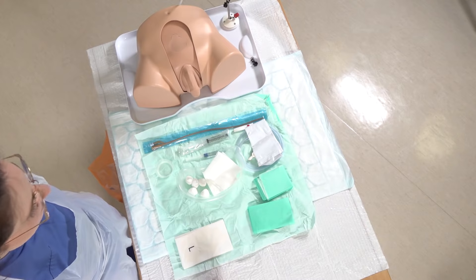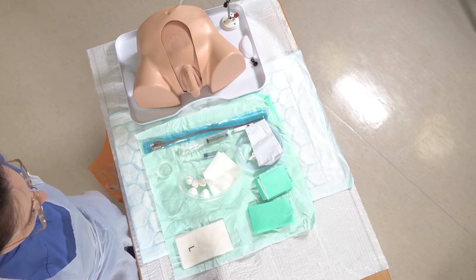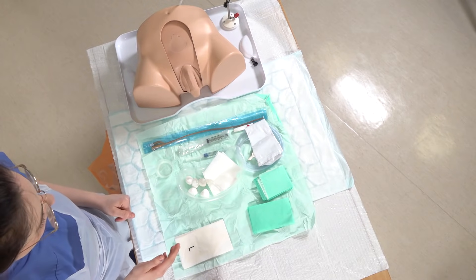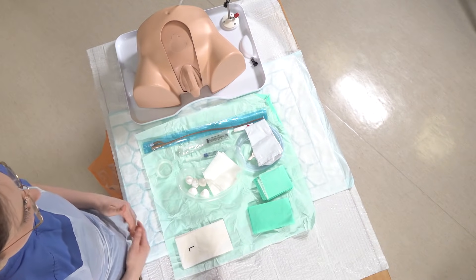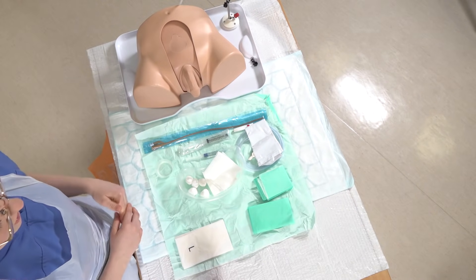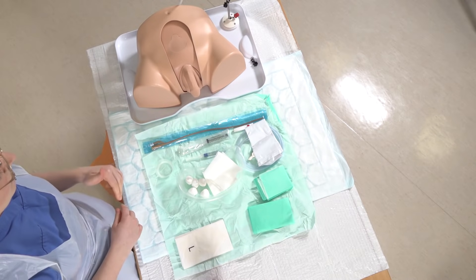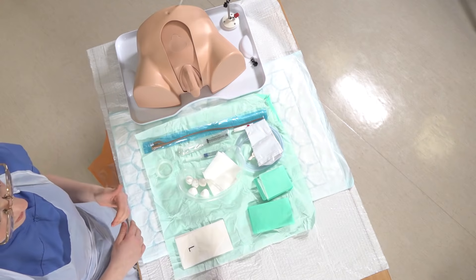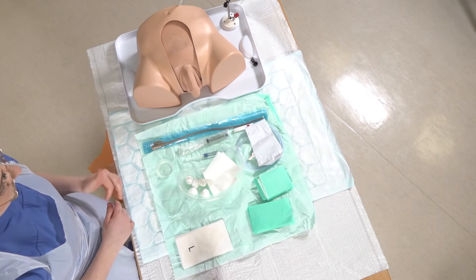Hello. So today we're going to be doing male catheterisation. I've pre-prepared my sterile fields and we've got everything that we need — I'll talk through everything in more detail as we go along. In terms of patient position, ask the patient to lie on their back and expose themselves. You can also ask the patient to retract their own foreskin if they're able to do so.